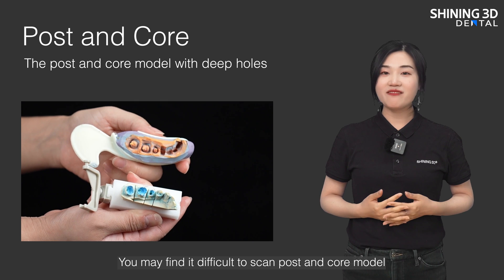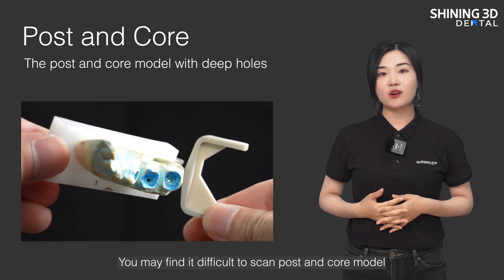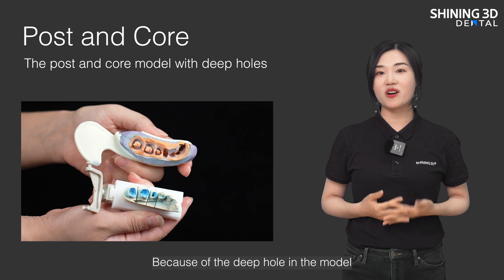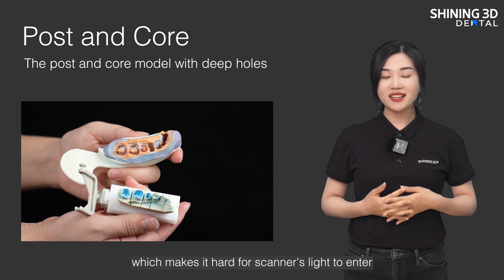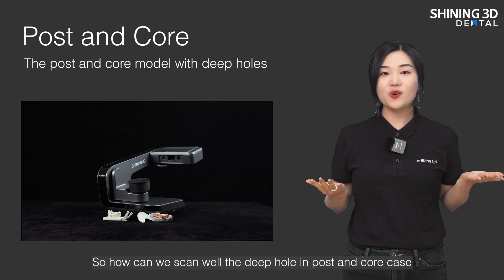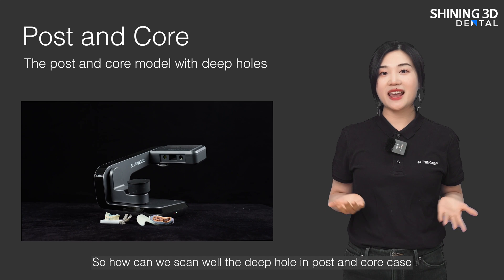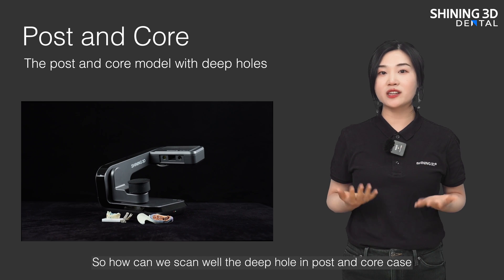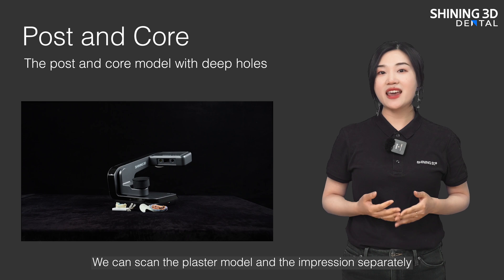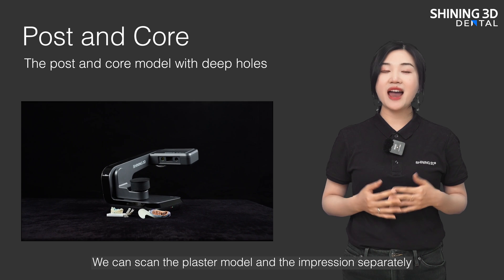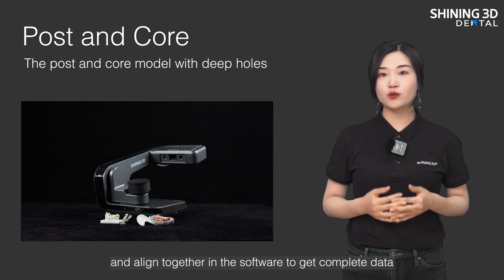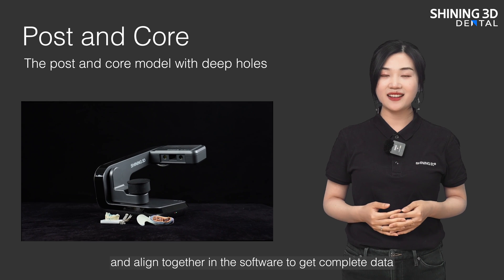You may find it very difficult to scan a post and core model. Why? Because of the deep hole in the model, which makes it hard for the scanner light to enter. So how can we scan the deep hole in a post and core case? Very easy — we can scan the plaster model and the impression separately and align them together in the software to get complete data.